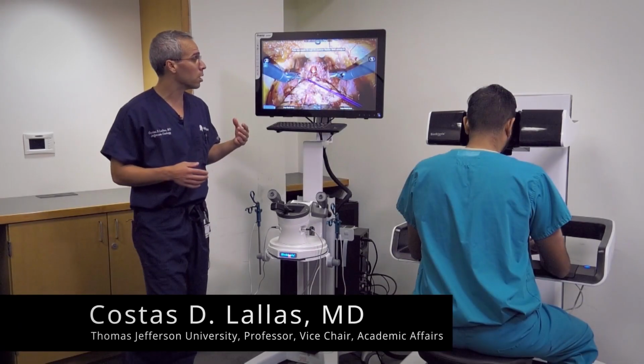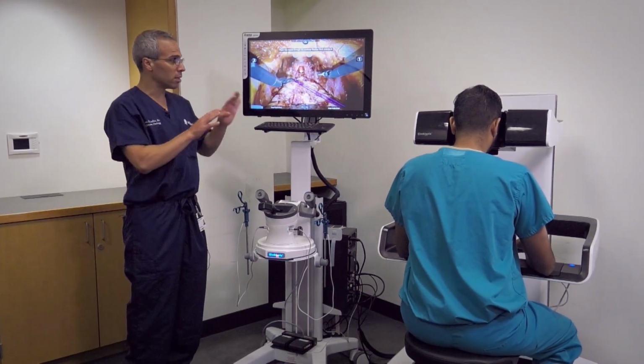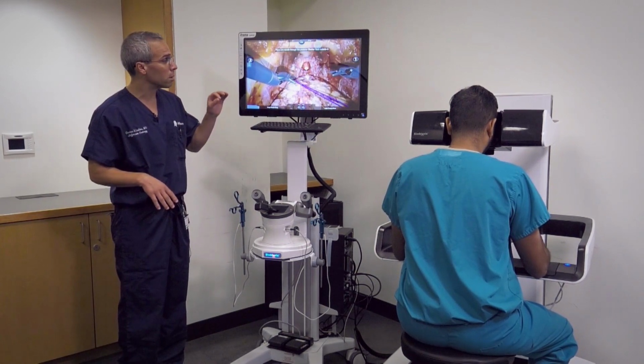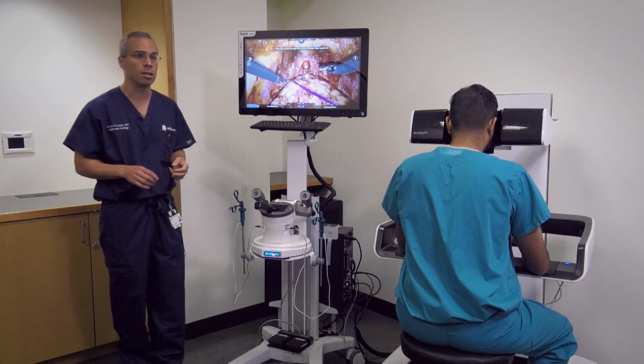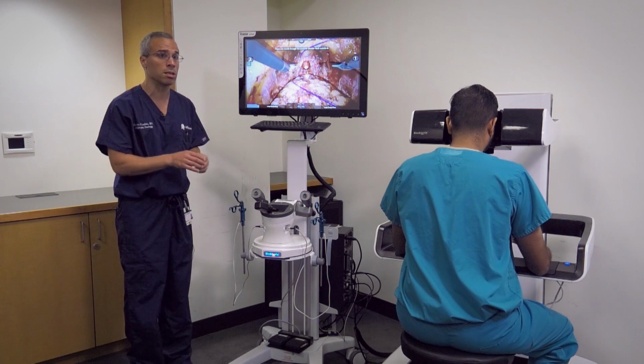This is the anastomotic model. So prostate's out. Now we're going to bring things back together again. And I have one of our chief residents here. This is Dr. Amar Rabal. So Amar, this is his 6th year of residency.